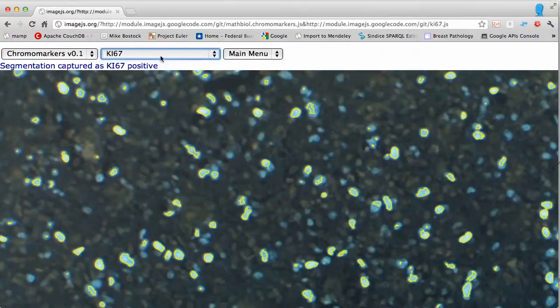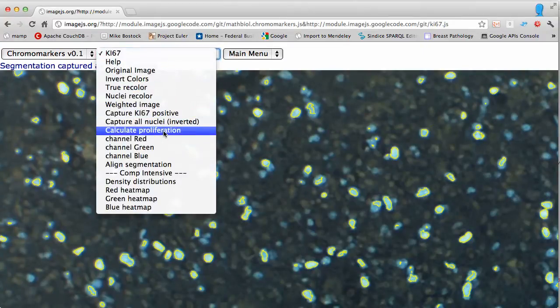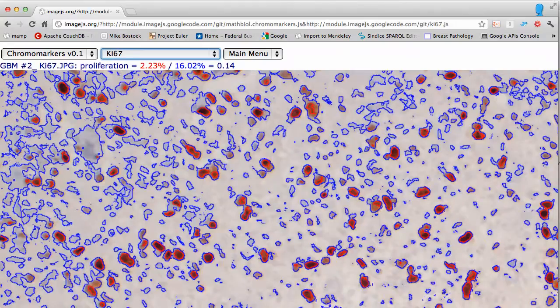This requires you to segment again and recalculate the proliferation values, which are of course significantly smaller now.